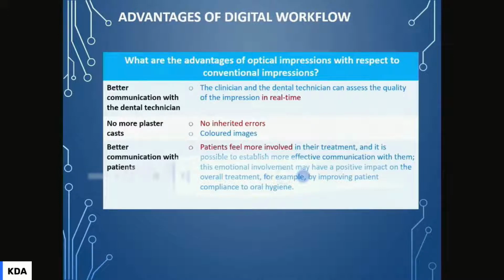The lab can see the images, we can see the images, and sometimes in real time, we can send the image, the lab can check if there is an undercut, if there is a lack of margin, or if the implant was not scanned properly, and can guide us, and we can retake the scan on the spot. No plaster, no errors, no broken plasters.